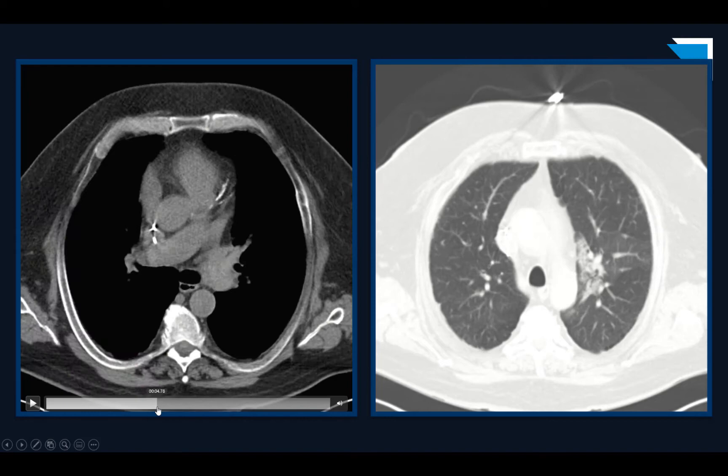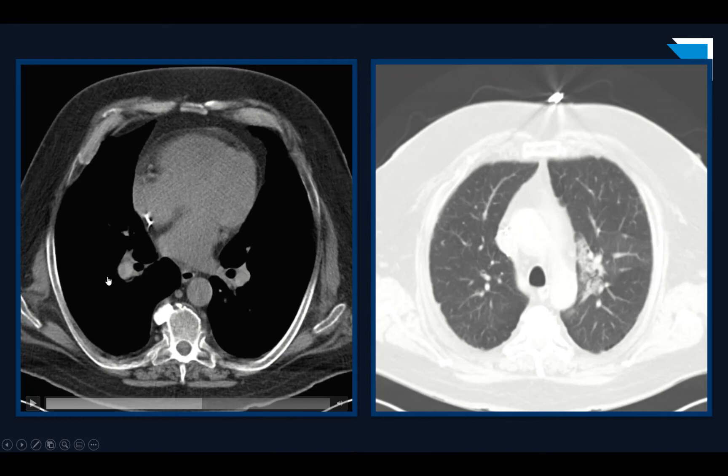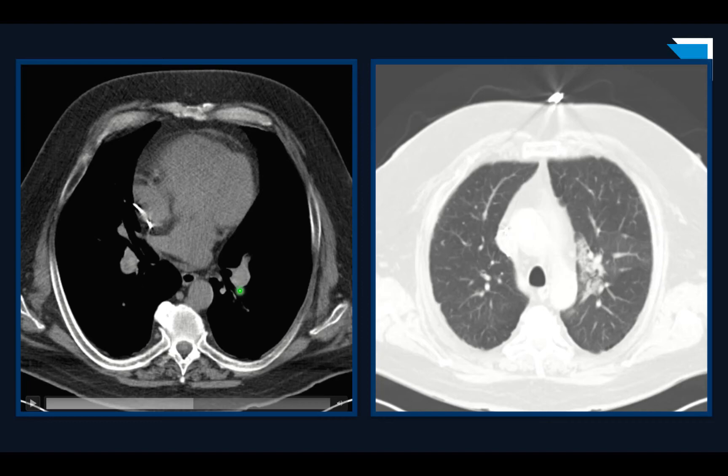Within the main pulmonary artery, you will see some very subtle linear high-attenuation material here at the main pulmonary artery bifurcation. If we look down at the right lower lobe pulmonary artery, it's heterogeneous — some higher attenuation material, some lower attenuation areas. Similarly, at the left lower lobe, higher attenuation material amongst some lower attenuation areas.